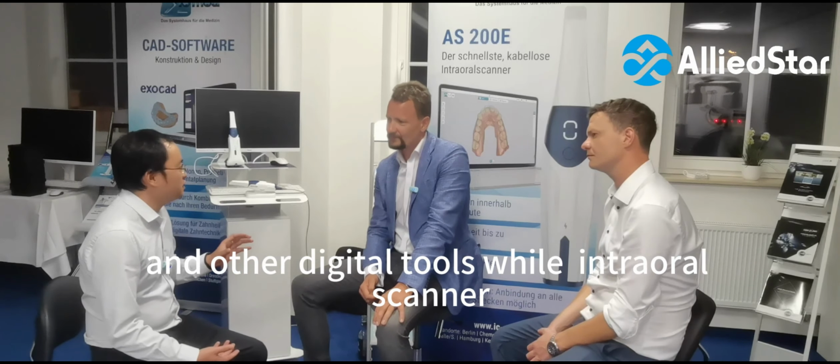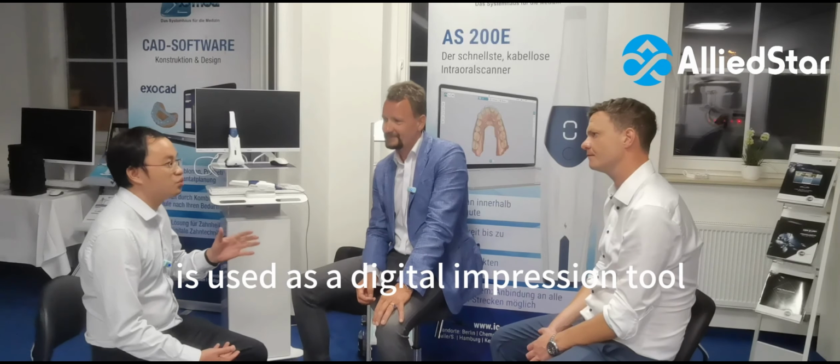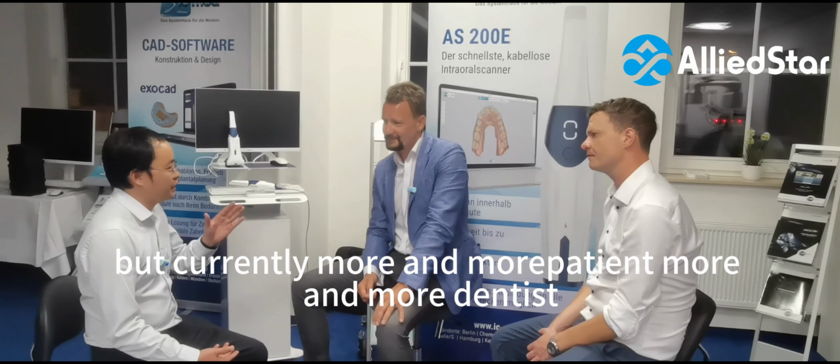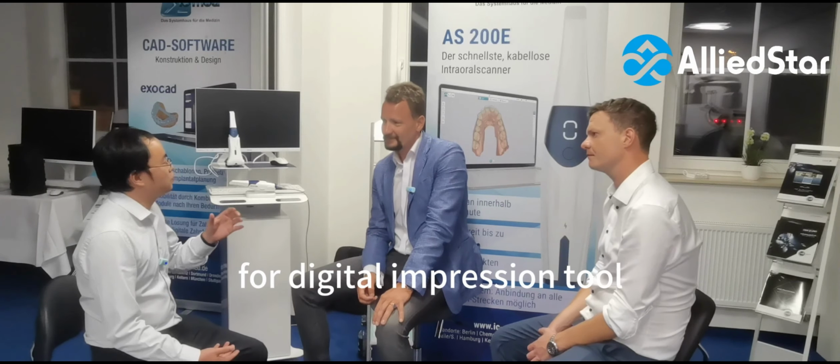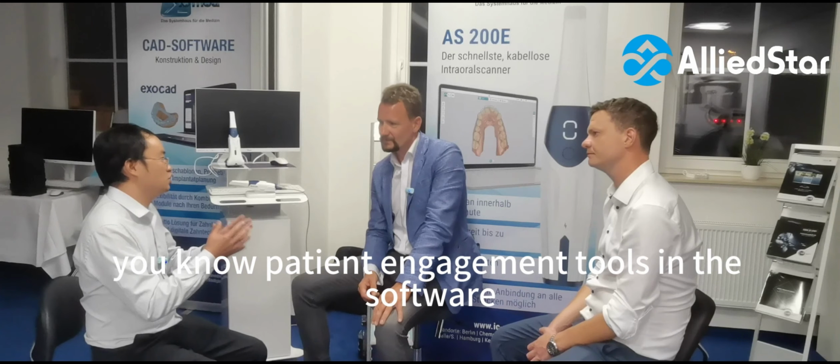Well, the intraoral scanner, from the first system introduced to the market, was used as a digital impression tool. But currently, more and more dentists are looking for an intraoral scanner not just as a digital impression tool. They are also looking for a communication tool that helps them communicate with the patient better, with the patient engagement tools in the software of the scanner system.